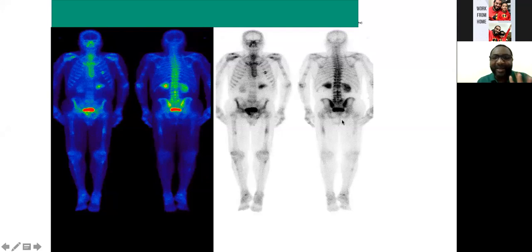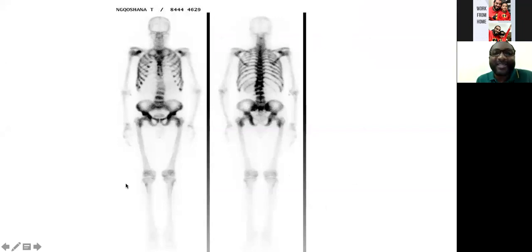But I am very happy with your approach. The important thing again is the approach. All right. And I'm very happy with your approach. Thank you, Dr. So I will show the next patient, next scan.